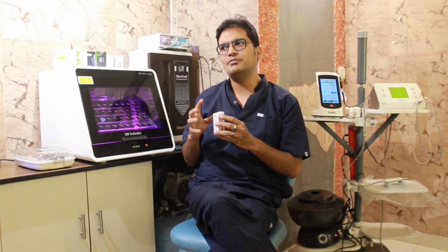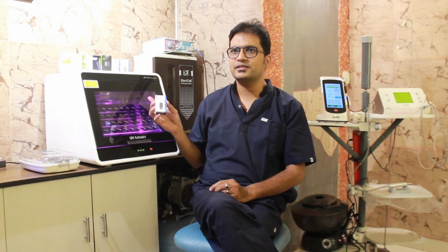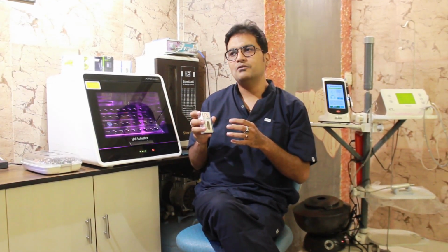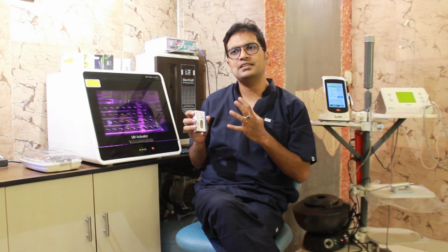The normal, regular implants are usually hydrophobic implants, and when this gets charged in the cabinet, it becomes a hydrophilic implant, thus helping it to attract more blood and get integrated within the bone very fast. The normal healing period of a regular implant is 60 days, whereas UV implants, according to studies, usually get healed within 14 days.